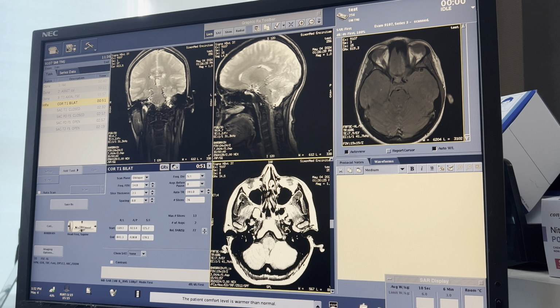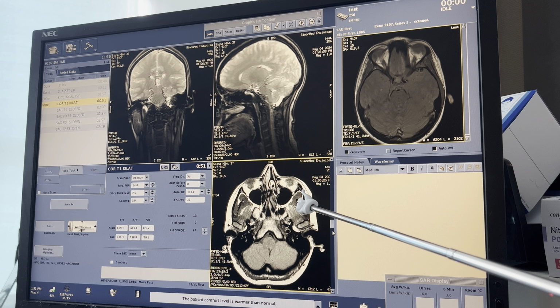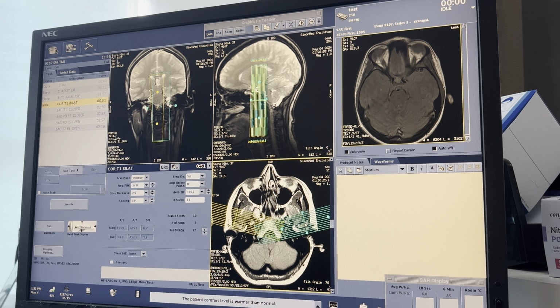Let's window it down to the right. So here you can see the beans very well. Those condyloid processes of the mandible. The coronoid processes would be like up here, right in here, give or take. Okay, so this looks like an excellent image, so we're gonna drop our slices right here, right on the bean. Perfect. We're gonna angle with the bean.